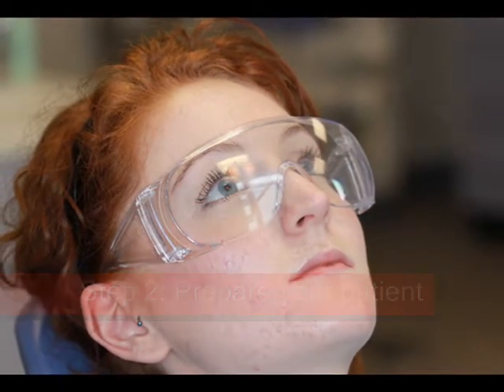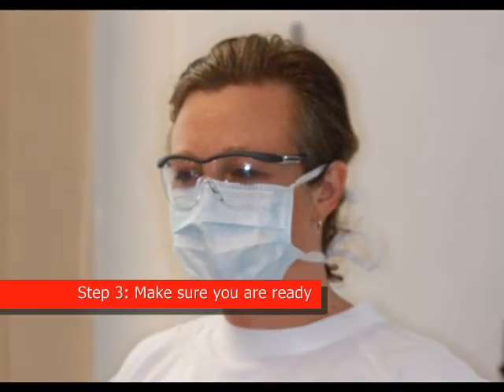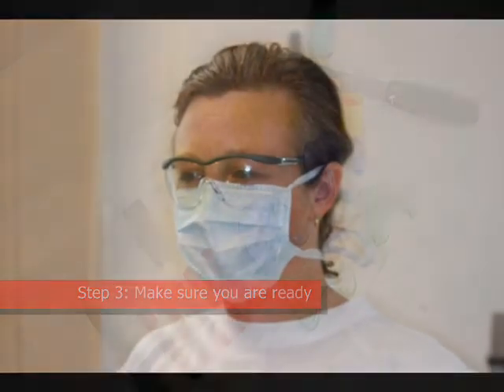Fully inform your patient and obtain verbal consent. Make sure you are clinically ready to take your alginate impression.